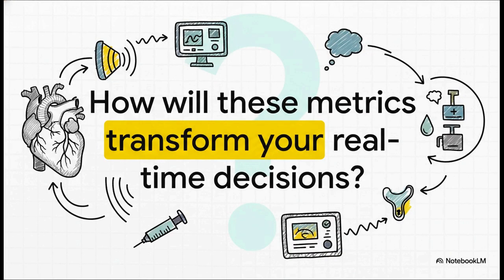We've covered a huge amount of information today, from the simple to the complex. We've seen how TEE takes us from just looking at the heart to truly quantifying its function. So I want to leave you with this question to think about. How can these advanced metrics actually transform your decision-making in the middle of a tough case? How will this change how you give fluids, when you start a pressor, or how you titrate an inotrope, all to get a better outcome for your patient? That, right there, is the true power of intraoperative TEE.